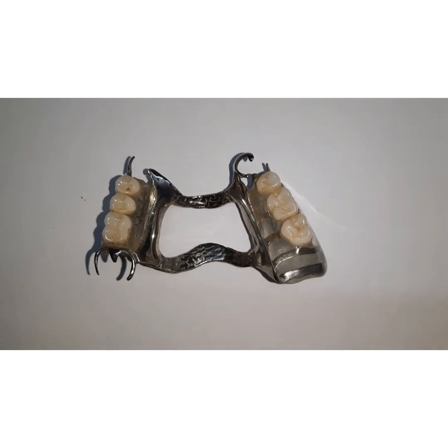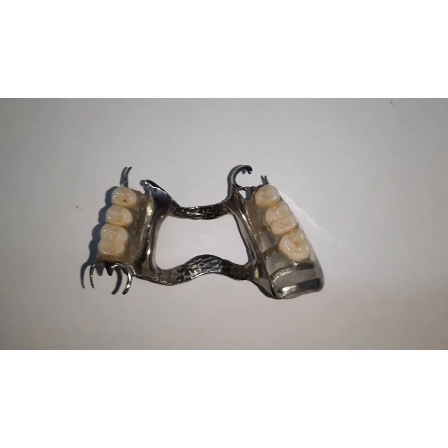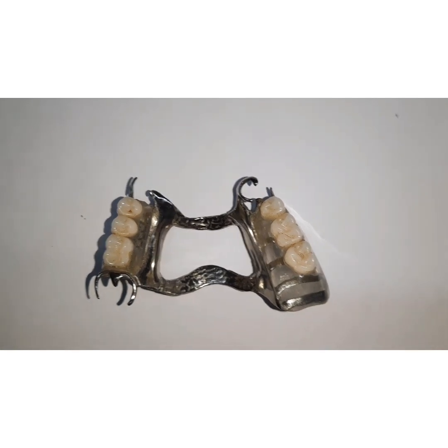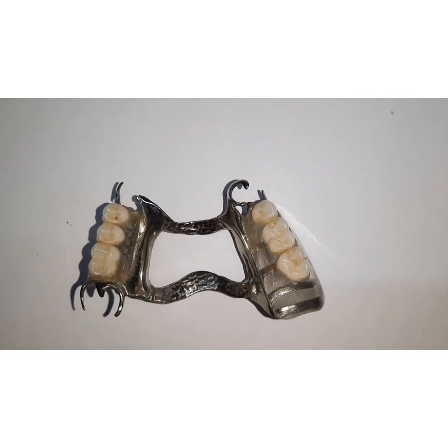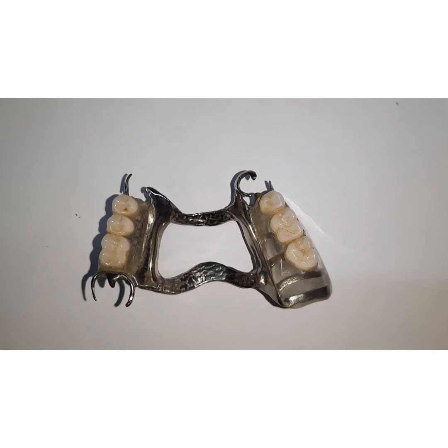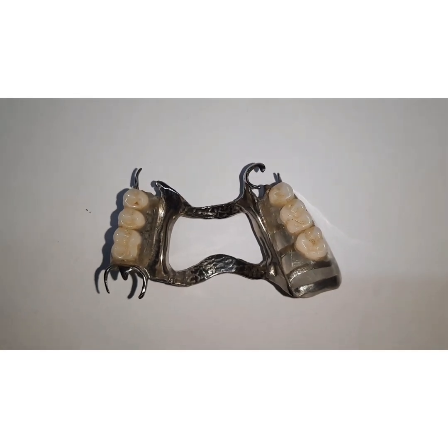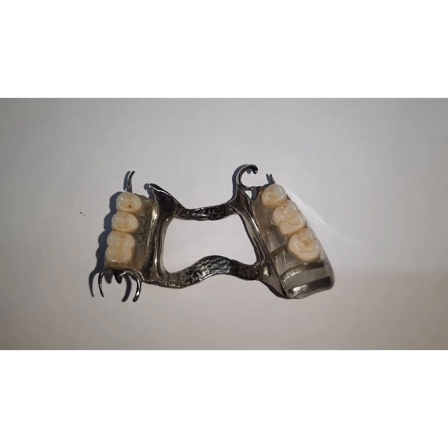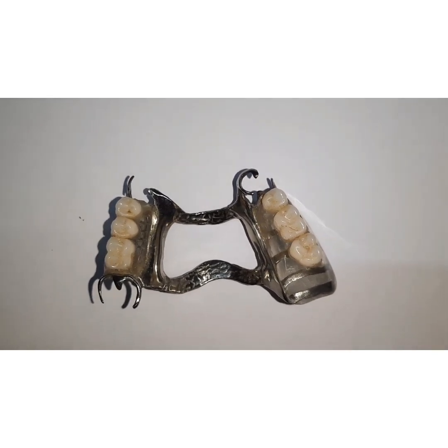If the pressure indicating paste wipes off, that means there is overextension and you need to reduce. Check for any signs like soreness or ulceration of the soft tissues that indicates that there is interference in their movement, and that needs to be ground with the help of appropriate abrasive.